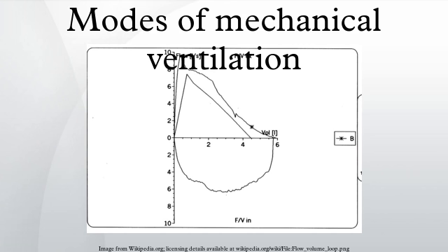Bilevel positive airway pressure. Bilevel positive airway pressure is a mode used during non-invasive positive pressure ventilation. First used in 1988 by Professor Benzer in Austria, it delivers a preset inspiratory positive airway pressure and expiratory positive airway pressure. BPAP can be described as a continuous positive airway pressure system with a time-cycled change of the applied CPAP level. CPAP, BPAP and other non-invasive ventilation modes have been shown to be effective management tools for chronic obstructive pulmonary disease and acute respiratory failure.